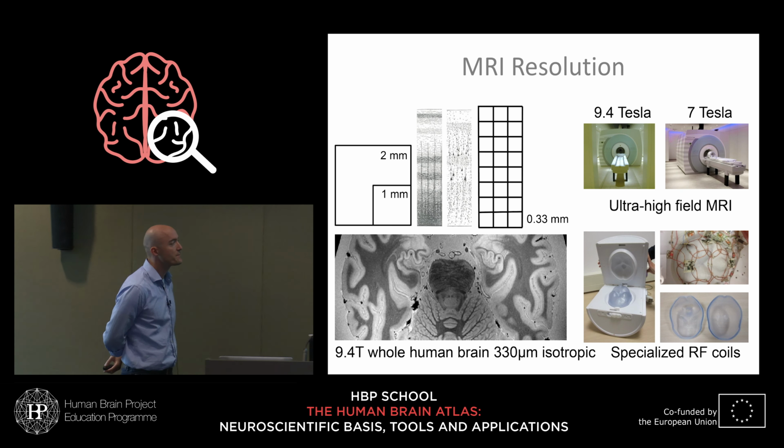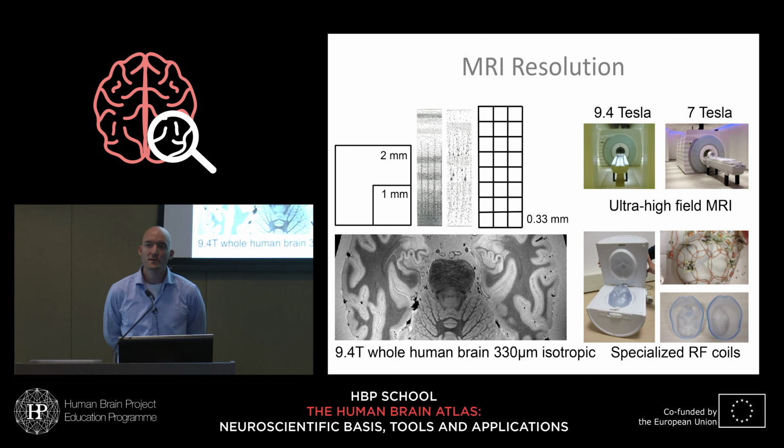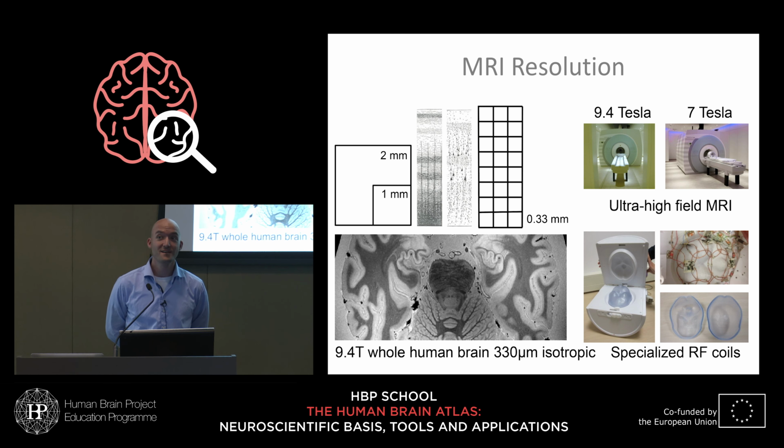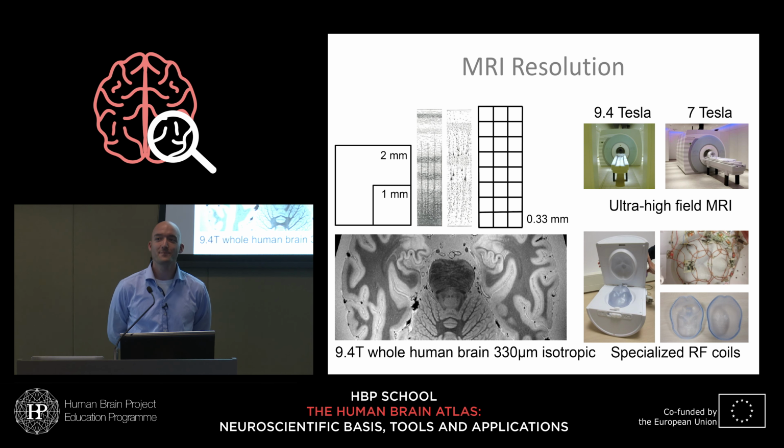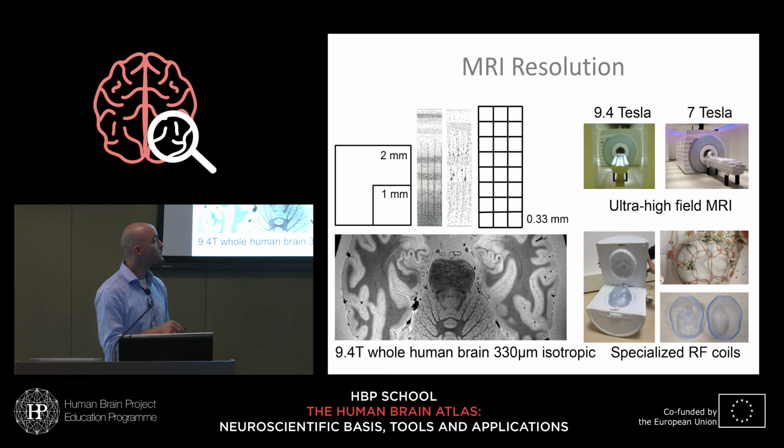Yeah, good question. So the limitations that come with the specialized hardware: when they work, they're fantastic, right? Now the limitations. They don't work very quickly because basically you build them yourself. We built these coils in-house. I'm already running a little bit ahead to my next slide, because part of my answer to you was going to be my next slide, but that's well timed. We spent 2 years on conceptualizing, building, and especially also optimizing, debugging, and perfecting this coil.